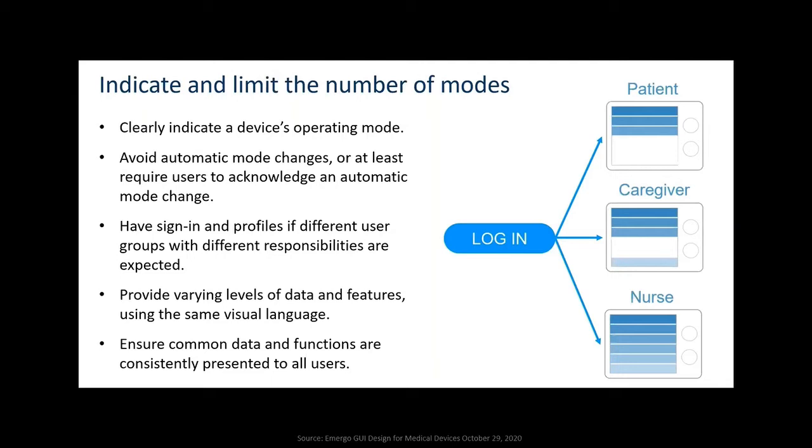This slide picks up a little bit on what you were talking about initially, Tim, which is there's going to be a number of different people that interact with the user interface and who have different requirements. But there are levels of hierarchy and detail that you have to build into the design, but also make sure that it is relevant and similar to all of those people, but they all have a slightly different nuanced experience with it.